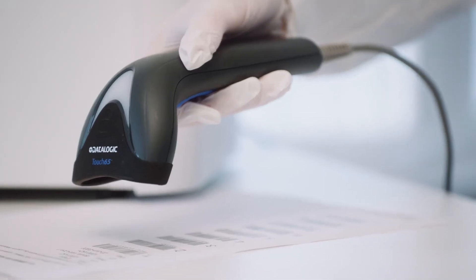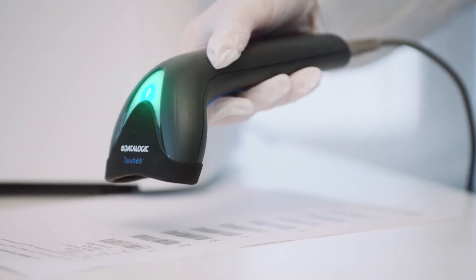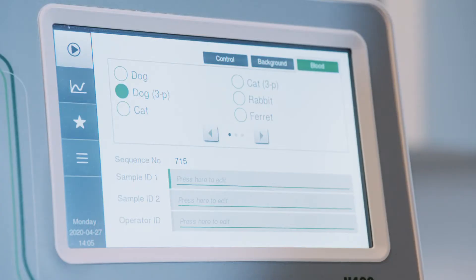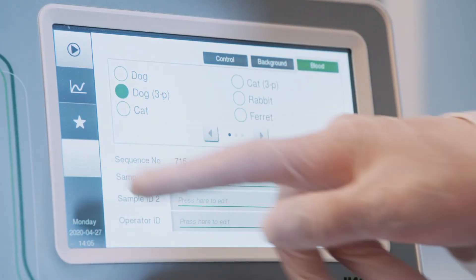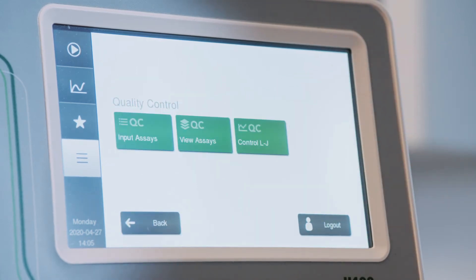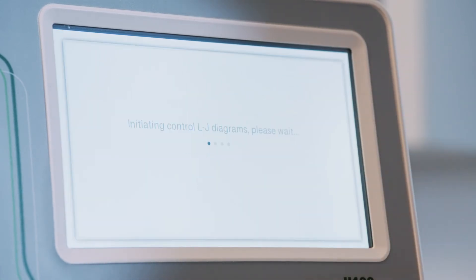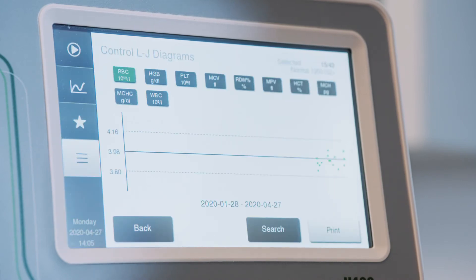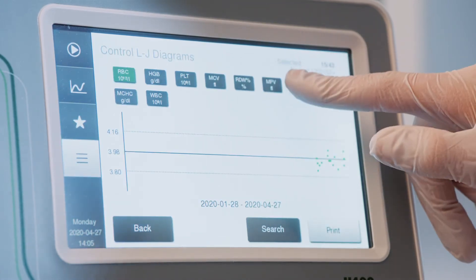In addition, a complete quality control program is on board every Exego H400 analyzer. Entering control information via the barcode scanner takes just a minute, after which QC data is on hand whenever you need it, along with Levey-Jennings diagrams to monitor the stability of the controls and instrument.